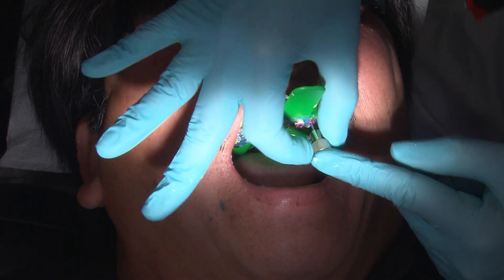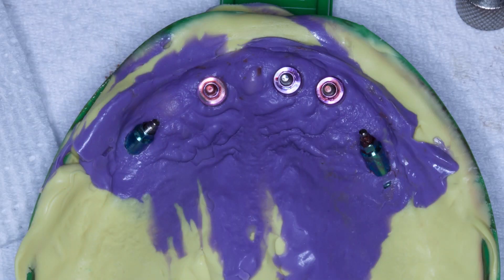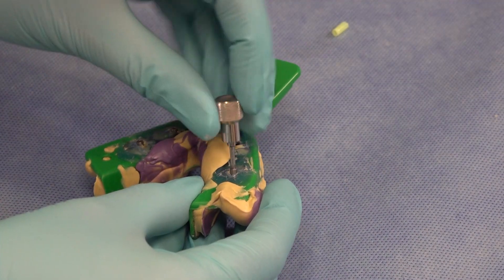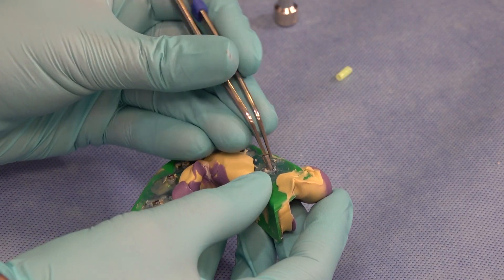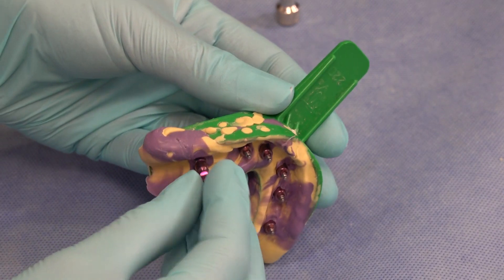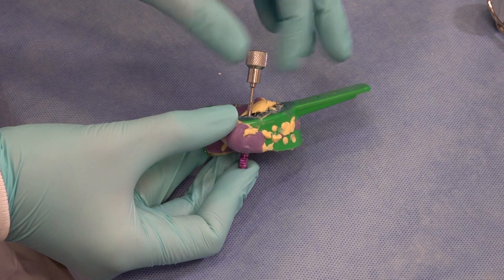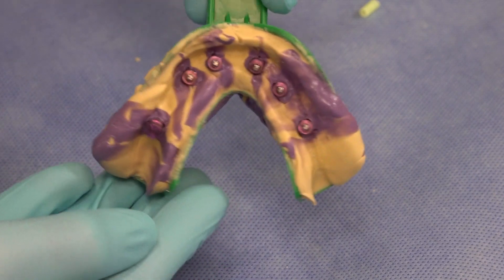Unscrew and completely disengage each guide pin before removing the impression from the patient's mouth. As soon as the impression is removed, replace the healing abutments right away to avoid soft tissue collapse. At this point, the guide pins will have to be inserted back into the impression or sent back to the lab, where they will be used to attach the analog component prior to the impression being poured. This is an example of how to attach an analog to the impression coping. The analogs are ordered separately and can be attached using either of the provided guide pins. If you do not wish to attach the analogs yourself, make sure that you send the guide pins along with your impression to the lab. Thank you for joining us. Back to you, Megan and Will.